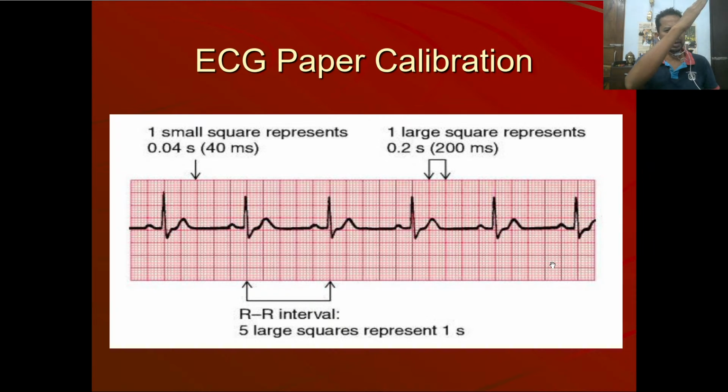So diagonally towards lead 2 the impulse is going. So lead 2 will record the best P wave, best R wave, and best T wave. Okay, and at this point you remember, again, take home message: T follows R. T wave will follow the R wave, and if this rule is broken, the patient is having some serious problem.